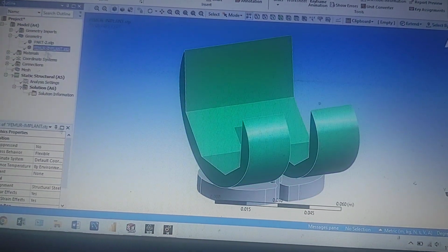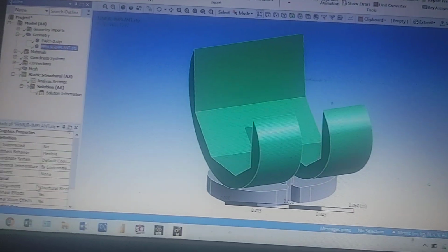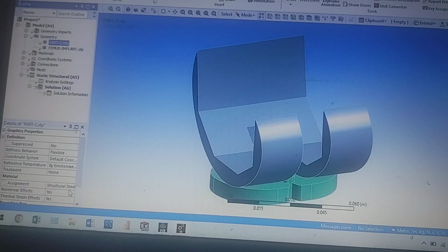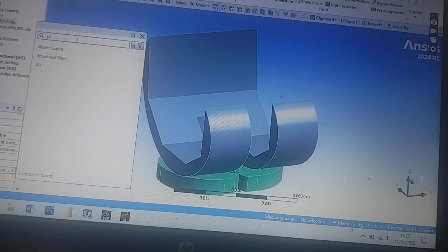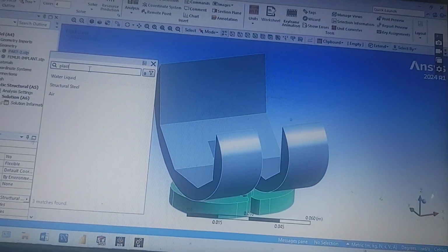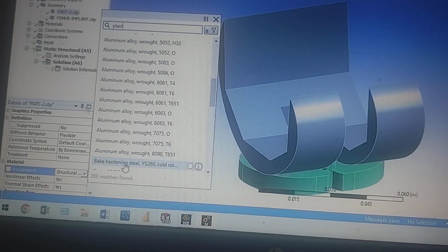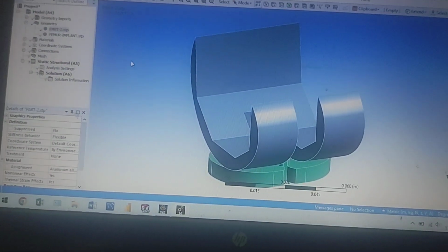Then go to geometry. There are two parts, Part 1 and Part 2. Go to Part 2 and assign material from here. Under material assignment, structure, change it to femur. Whatever material you want to add, you can add in the same way. You can also search from here: titanium, plastic, or any other material. There are a lot of materials: alloys, aluminium alloy, and so on. You have to add a biomaterial for this process.